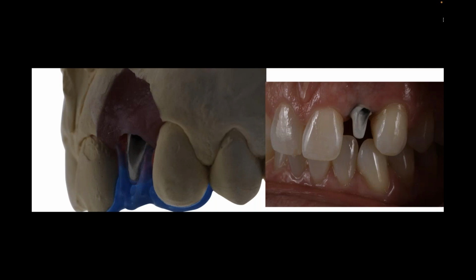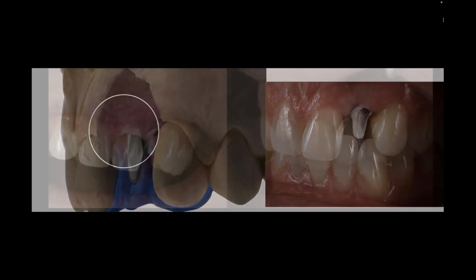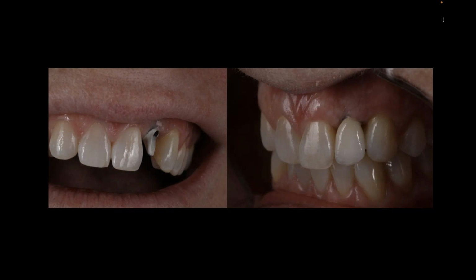So you can see to the right of your screen that now I'm actually getting my marginal finish line showing, and I'm going to have to drop that marginal finish line to make it accurate. So not a problem. The case will come back to me. I'll drop that marginal finish line.